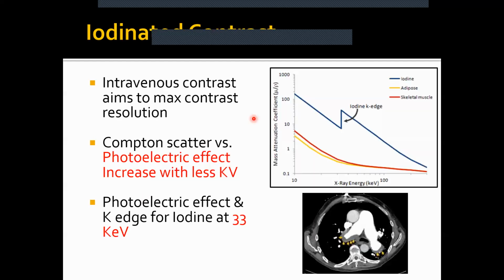Okay. So now we have our iodinated contrast. This is a little bit of a cheat sheet that doctors can use to help visualize structures more easily. So for example, in the mediastinum, you're going to have this case where there's something wrong going on with the aorta.